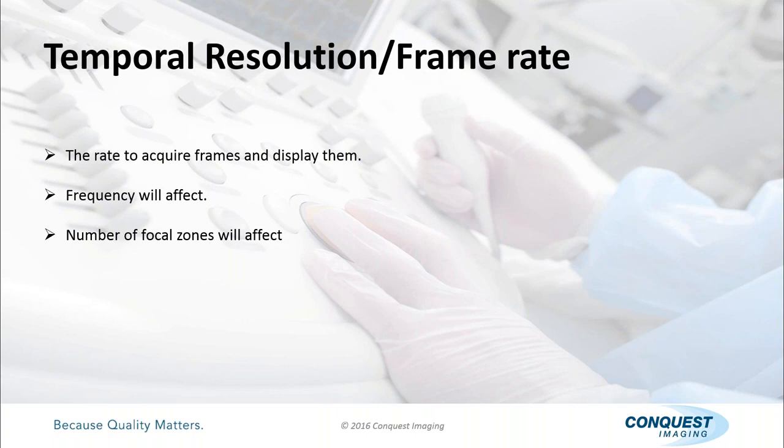Now imagine a picture that you have to build from top to bottom millions of times a second. And as you're doing this, you're targeting one specific spot in space, and then you're passing that information on. Then you target the next particular spot in space, and you do this over and over and over at millions of times a second.